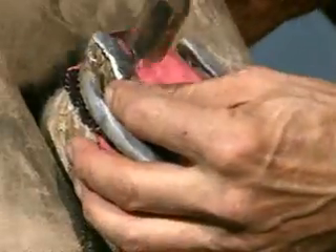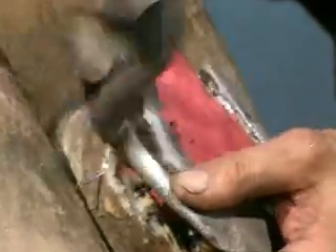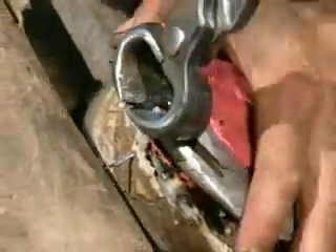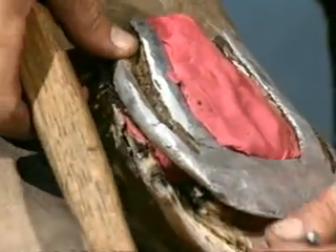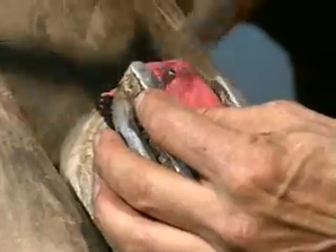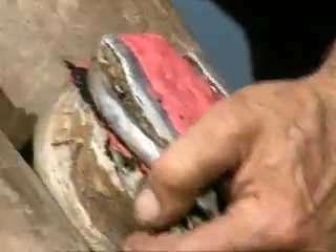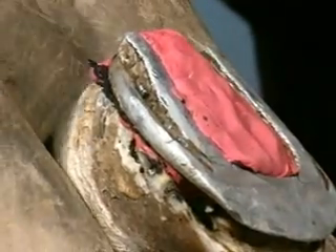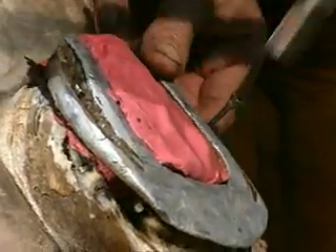When you're driving into the heel area, you've got to be very careful because you don't have a lot of wall. This particular nail didn't grab anything of any substance. Instead of clenching it over or pulling it over and destroying that part of the foot, simply pull it and go back to the next hole. You have to become experienced to become comfortable back here, but there's actually plenty of wall. If you pitch your nail holes both inside and out, then you have the liberty to find a place that you can nail with very low risk.